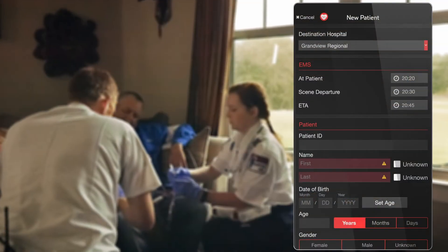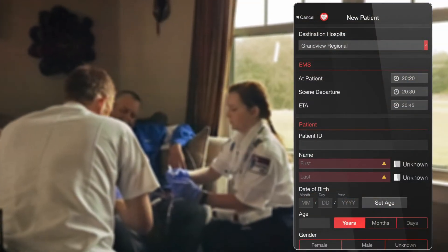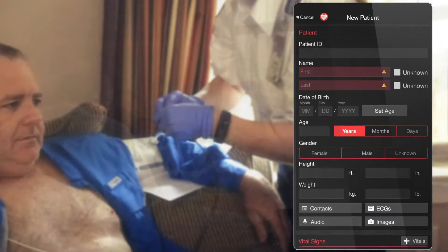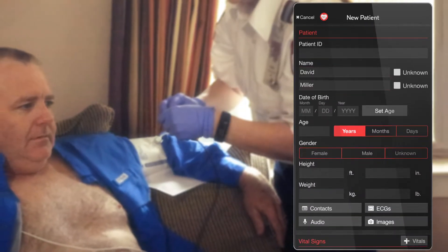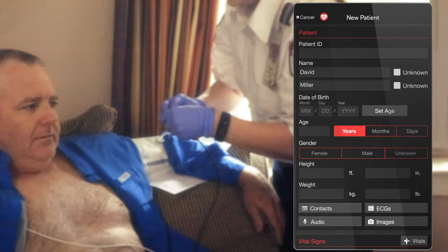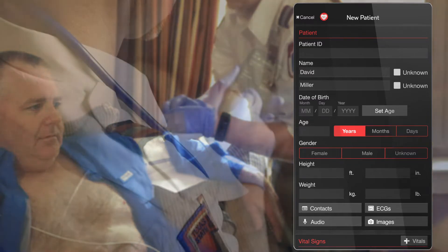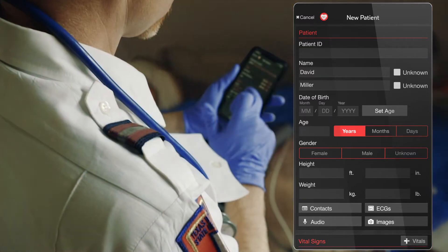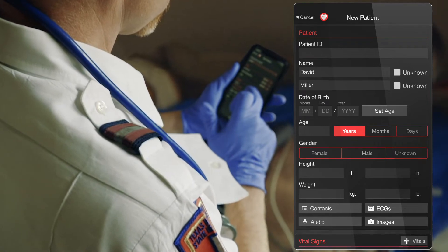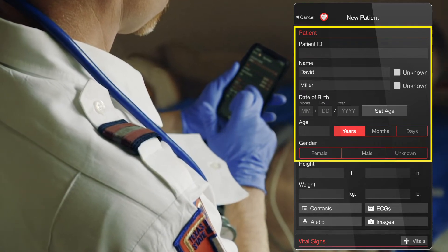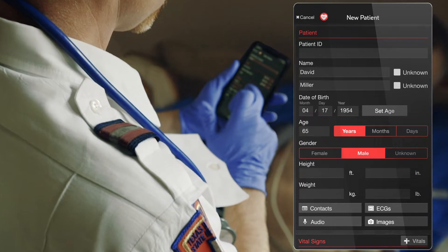A first responder or medic can create a dedicated patient channel by simply entering the patient name. Before starting to add the care team, it's important to add enough information so EMS crews can replace the traditional verbal report. Typically medics add some basic demographics like date of birth, age, and gender.